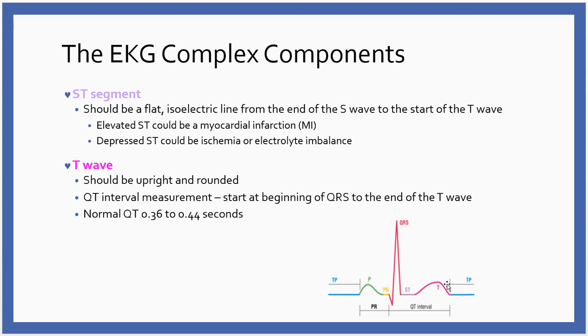The response can be lethal dysrhythmia, such as VTach, VFib, or torsades de pointes. And so the longer my QT interval is, the longer that danger zone is too. And so that's why I get concerned about the QT interval. I want to make sure that it's not too long, so that it doesn't risk the patient developing a lethal dysrhythmia.